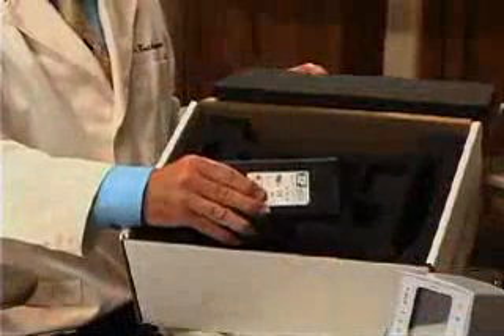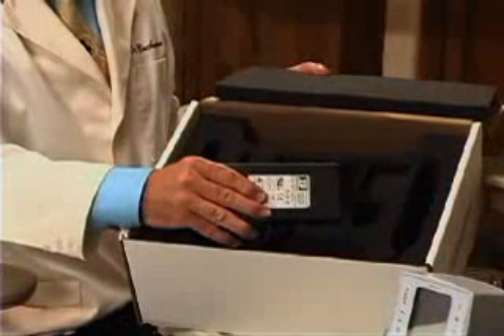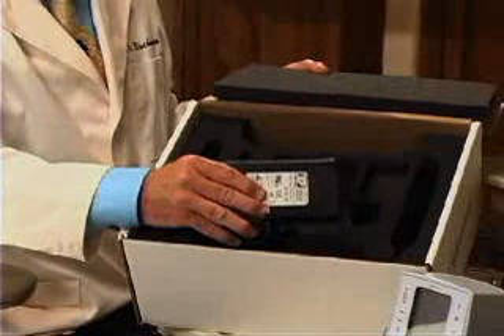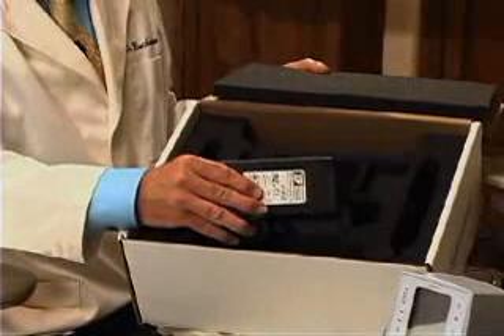This is the DC converter. I usually put that behind the cabinet or in a place that doesn't show. It provides low-voltage current to your System B elements unit so that it's safer in the operating environment.